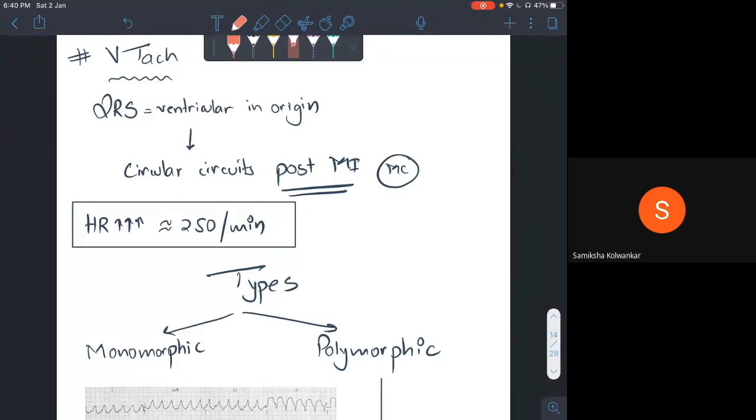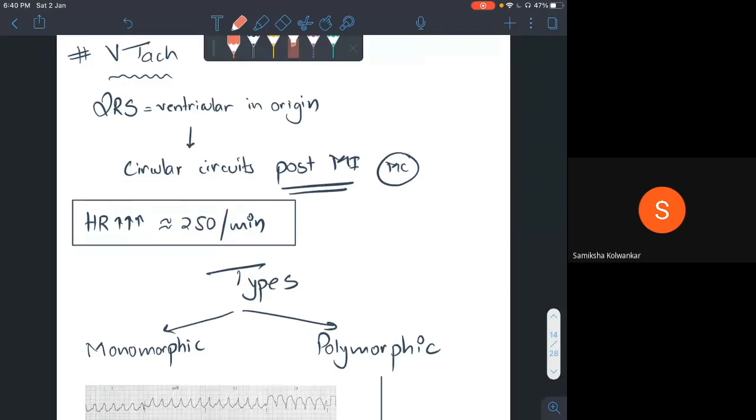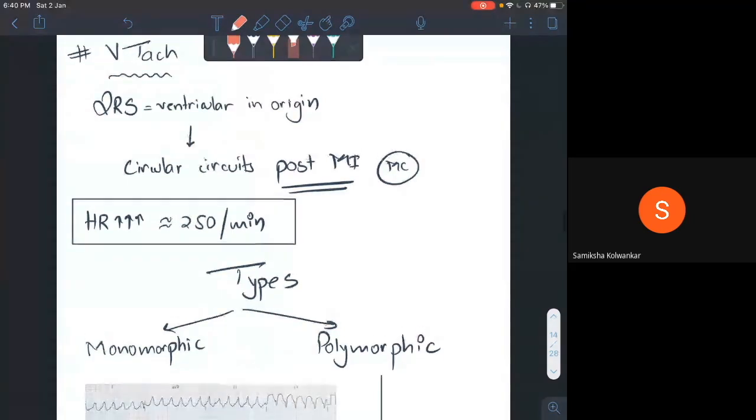This is where if you're sitting by a patient and you connect that patient to an ECG machine, and you see these waves, and you're able to diagnose them, you can yourself administer what needs to be given, and call in a crash cart and do the DC shock, or whatever you feel is the right approach to it, because this is one of those cases where the treatment is straightforward. The only problem is identifying it.